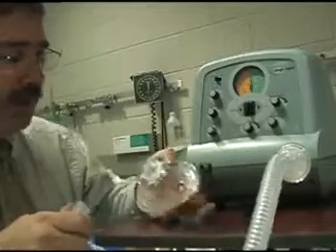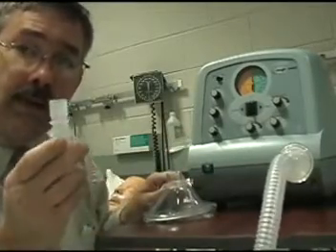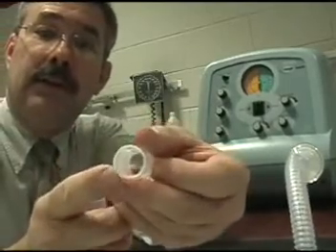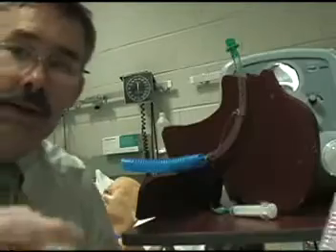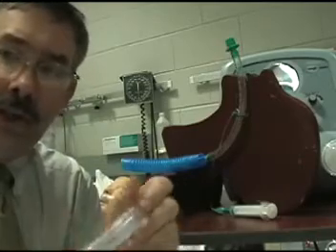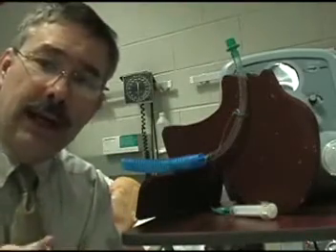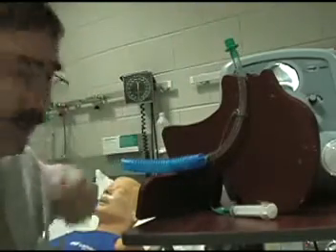Frankly I don't like this tube simply for one small fact — this little adapter does not fit. This is not the size that you need for an endo tube. If you're using this adapter and you need to attach it to the endo tube, you'll notice that it does not fit because the diameter is wrong. It's too large and it doesn't fit.